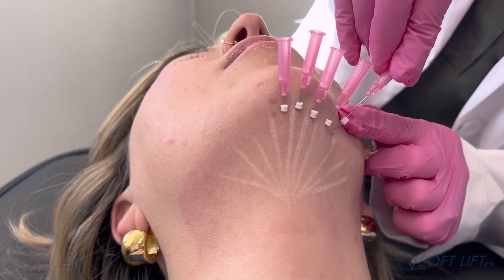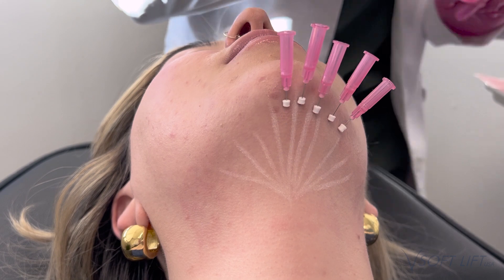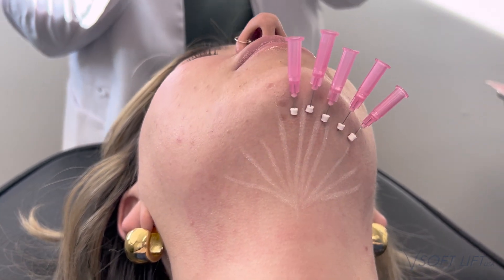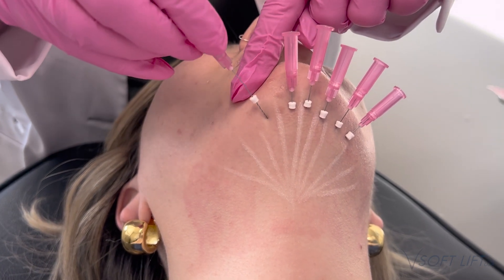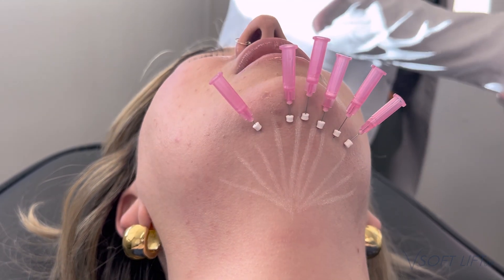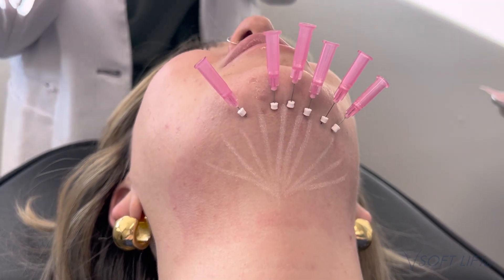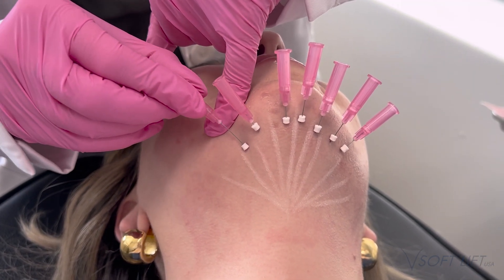This patient just has a very small submental pocket that she's looking to target. She was not a candidate for Kybella or a fat dissolver in this area, so she does have this small pocket. With PDO threads, not only are we stimulating that collagen production, but it can also help initiate lipolysis as well.